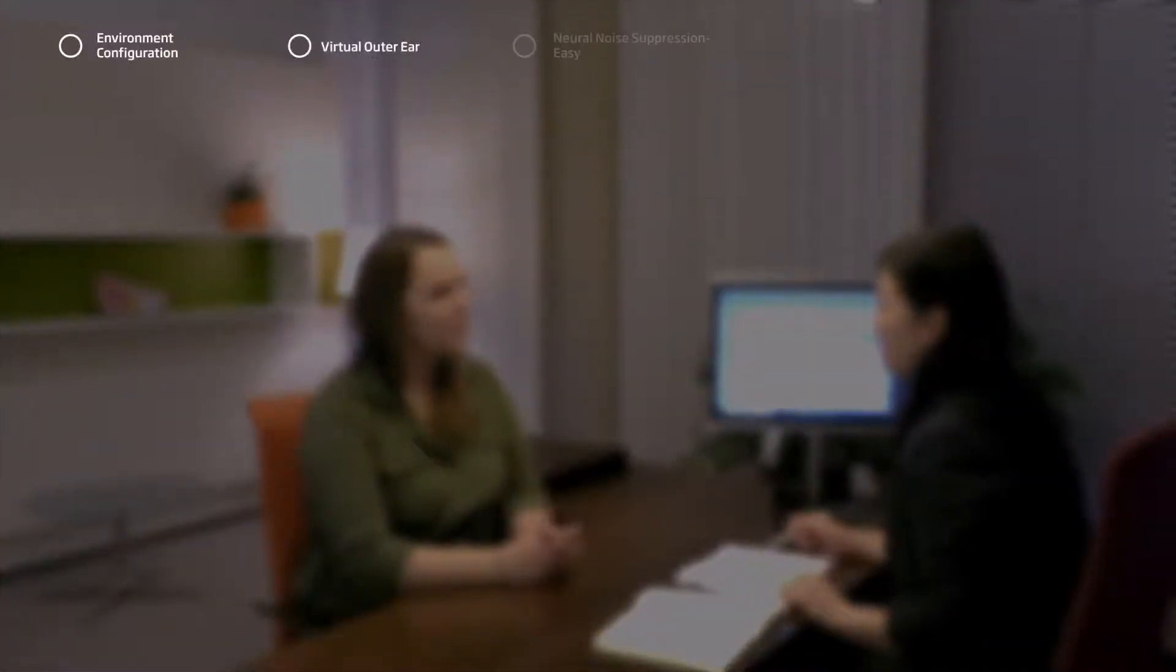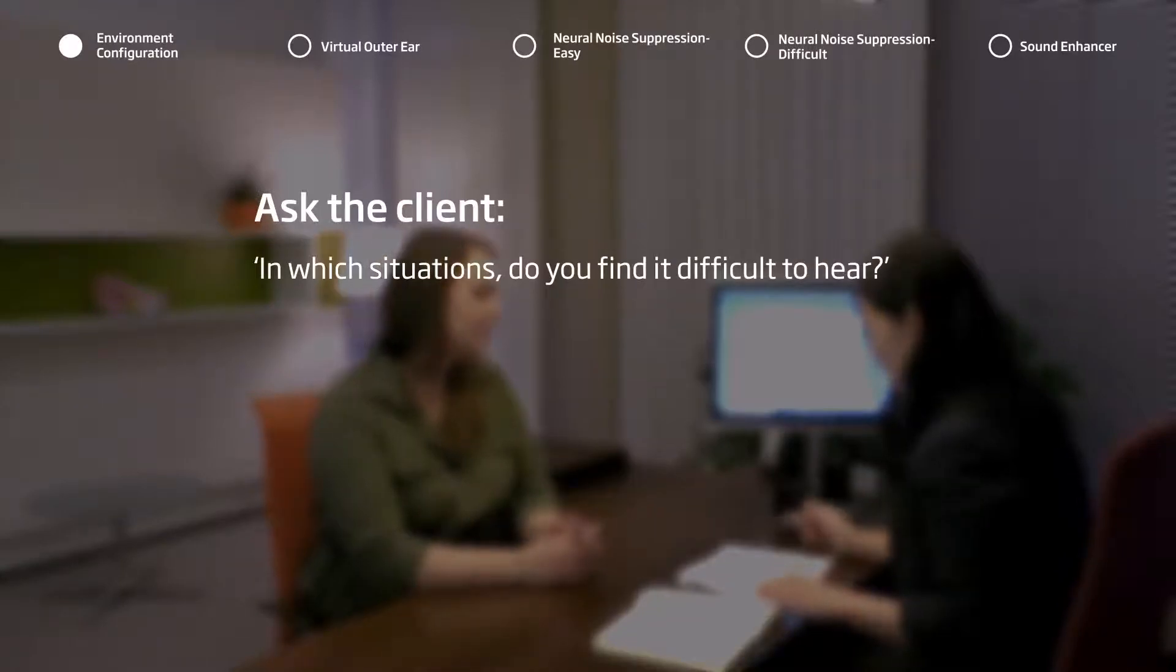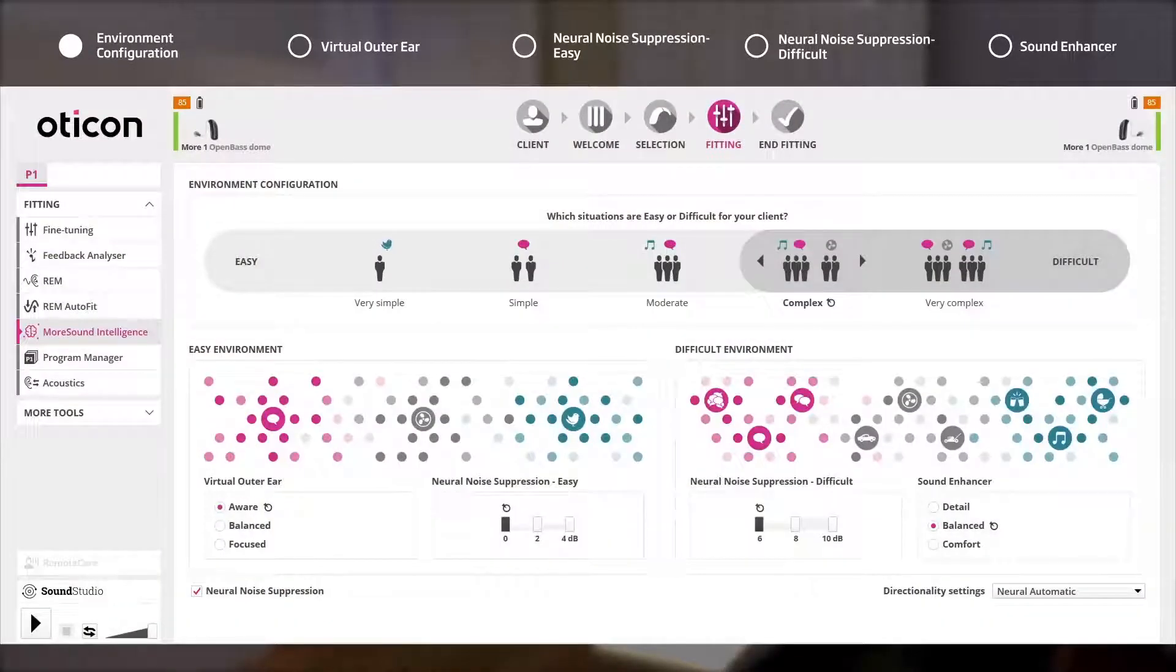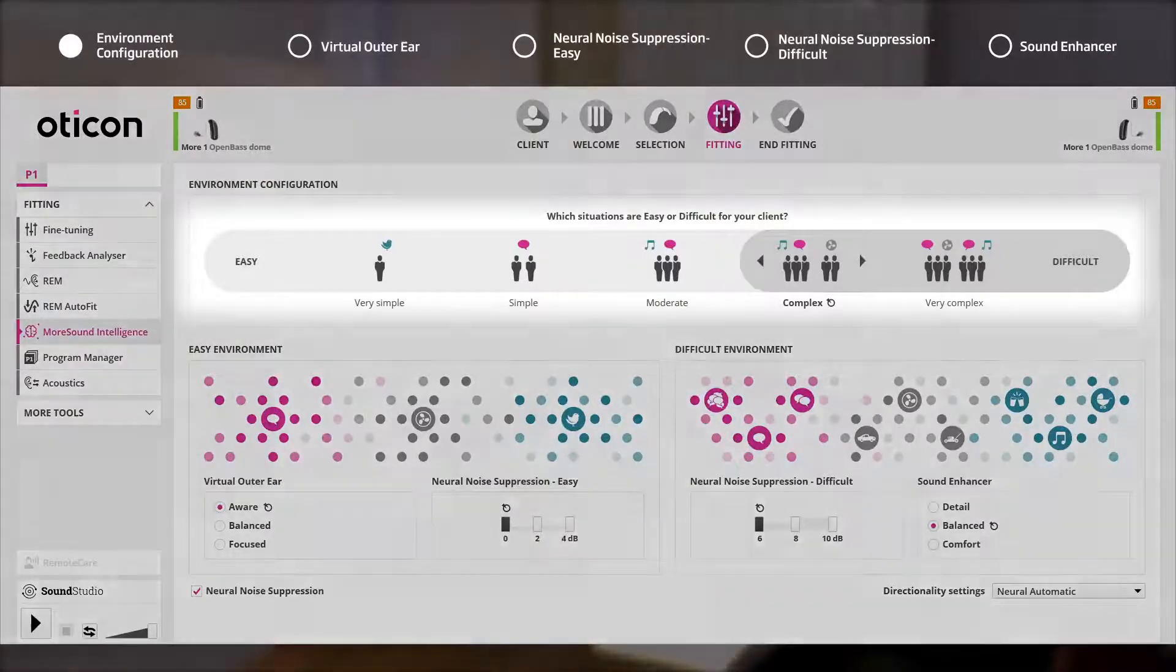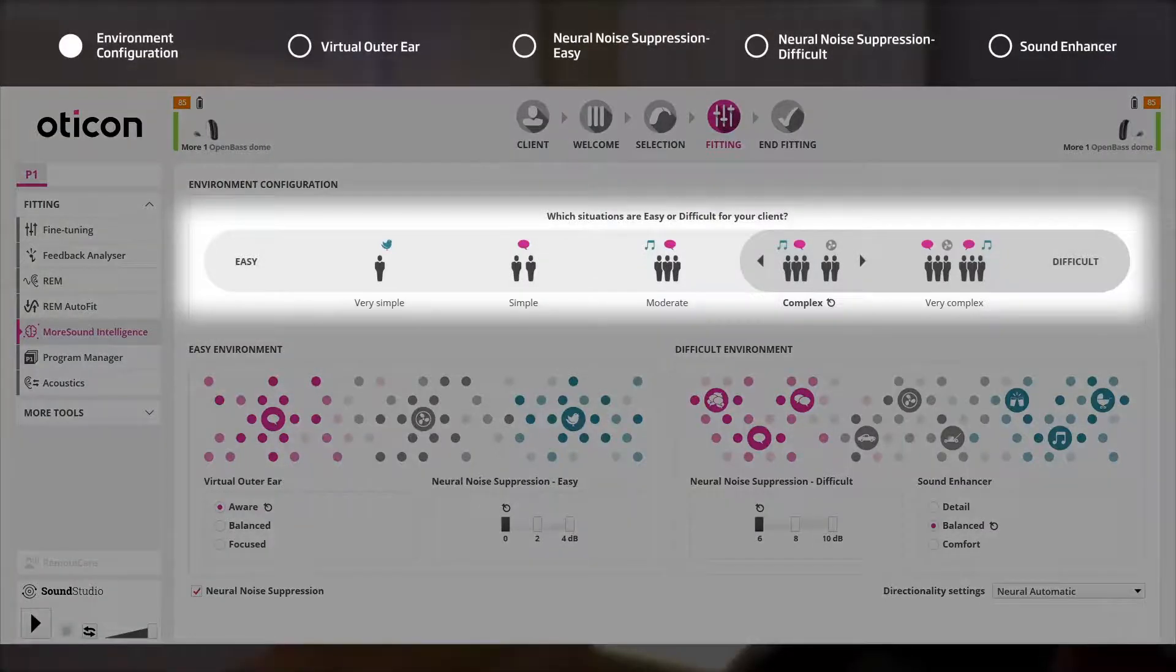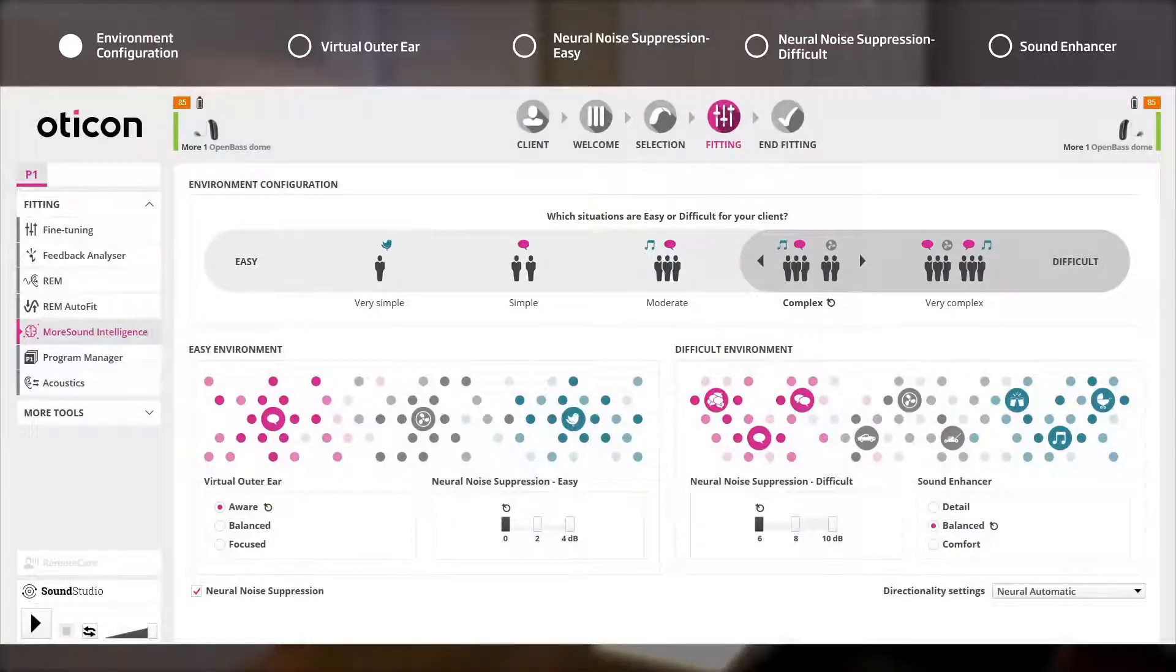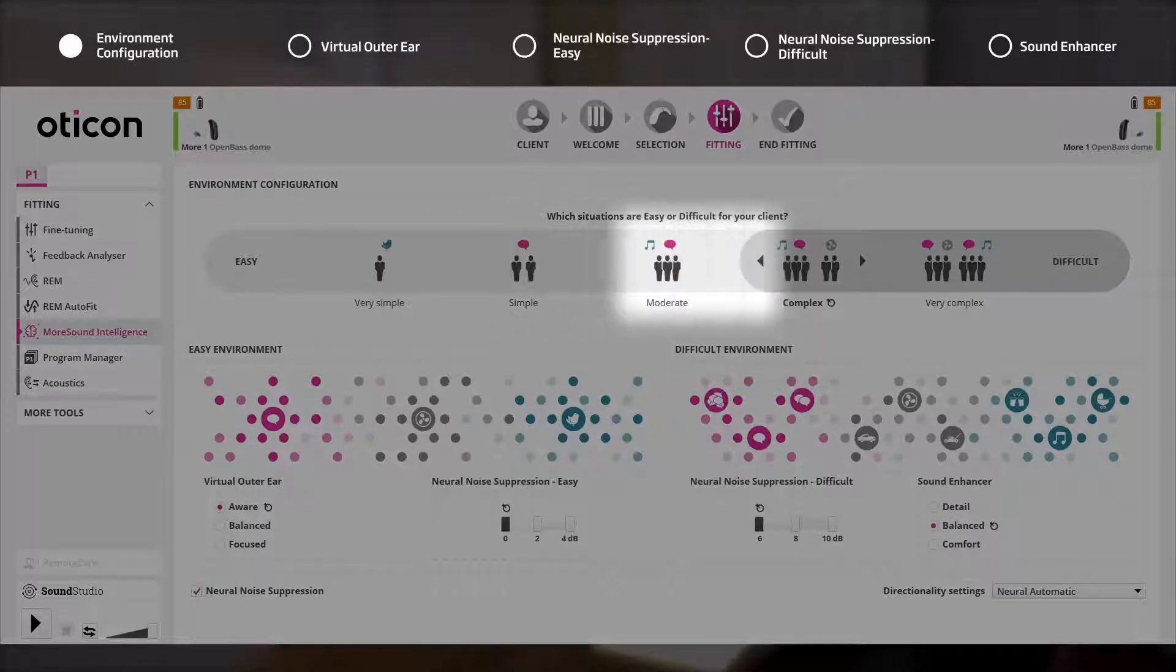There are five elements in the More Sound Intelligence fitting tool. As the difficulty a user experiences in hearing varies from individual to individual, Environment Configuration allows the hearing care professional to pinpoint exactly the kind of environment the user will begin to experience difficulty. This in turn will dictate how much help the user will get in different environments and the activation of automatics. Oticon recommends the hearing care professionals ask in which situations do you find it difficult to hear and go through each situation from very simple to very complex.